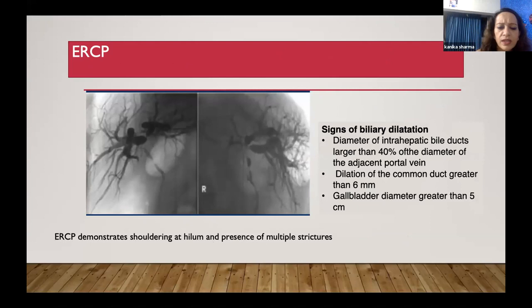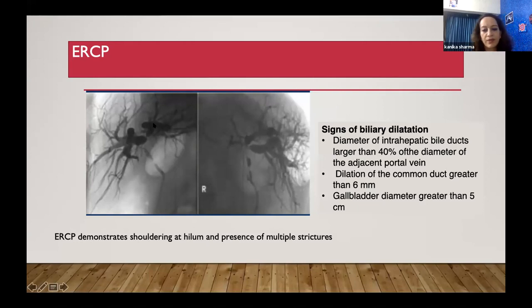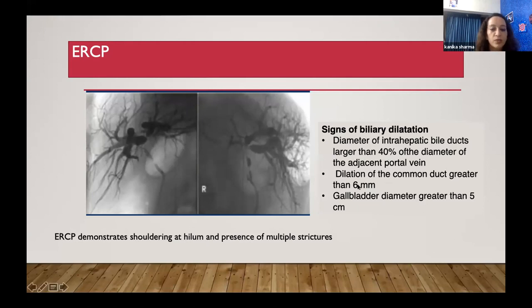On ERCP, this is a Bismuth-Corlette type 4: you can see dilatation of both ducts and the confluence is not visible, with strictures present. Significant biliary dilatation is defined as intrahepatic bile ducts dilated more than 40% of the portal vein diameter, CBD dilatation more than 6 mm, or gallbladder diameter more than 5 cm. These indicate obstruction distal to the dilatation, and you can look for the tumor at that site.